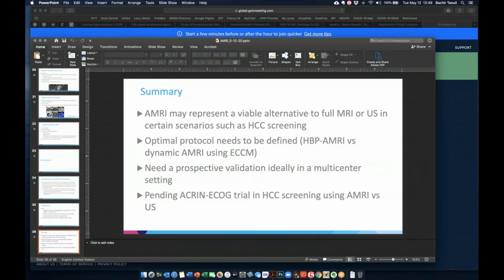Oh, great. So one of our ex-residents who's now a faculty at Stanford, his name is Ryan Brunsing. He did recently publish a paper in one of the radiology journals, in which he summarized our real-world experience using abbreviated MRI. So not a simulated MRI protocol, but a real abbreviated MRI protocol in HCC surveillance. In his analysis of the first couple years in which we were doing it at UCSD, he found that the per patient sensitivity was on the order of 80 to 90%.